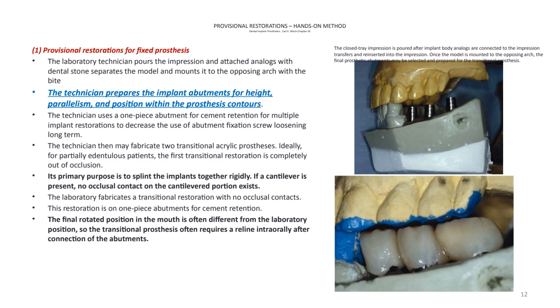And also, once the osseointegration process has taken place, and let's say the patient still needs to use the temporary provisionals because other implants need to be placed in the mouth, or additional surgeries will be necessary, then the second set of temporaries can be fabricated, and then the second set of temporaries can be made more towards having a centric relationship.